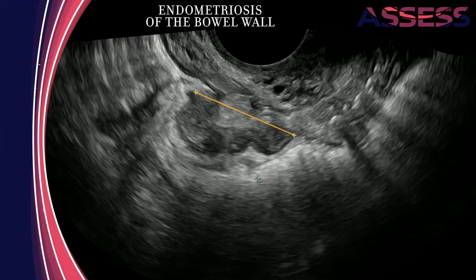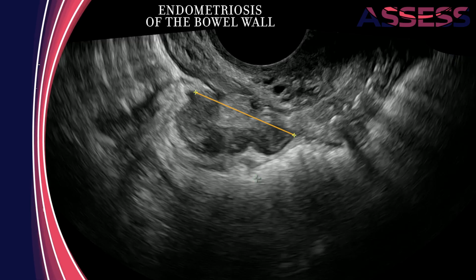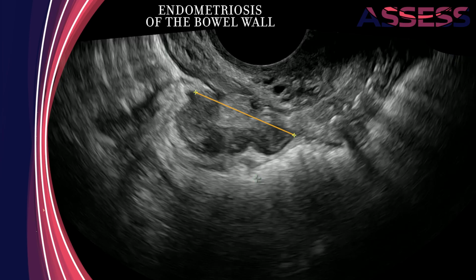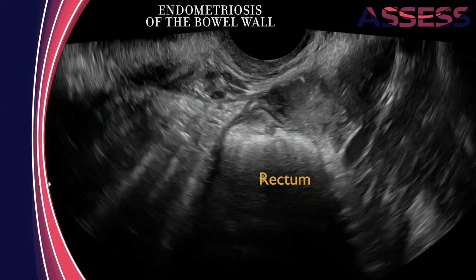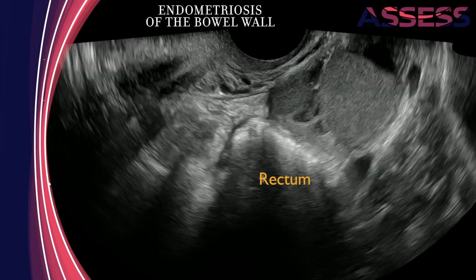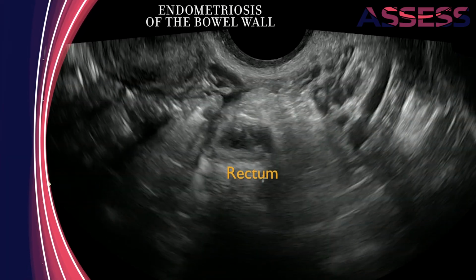Place calipers on each end of the area, including all of the thickened hypoechoic area up to the normal thin bowel wall. On the same image, place calipers perpendicular to the first set, at the thickest point of the hypoechoic area to measure the thickness. Rotate the probe 90 degrees to sit transversely on the bowel, to view a round cross-section and sweep through the affected area in this orientation.